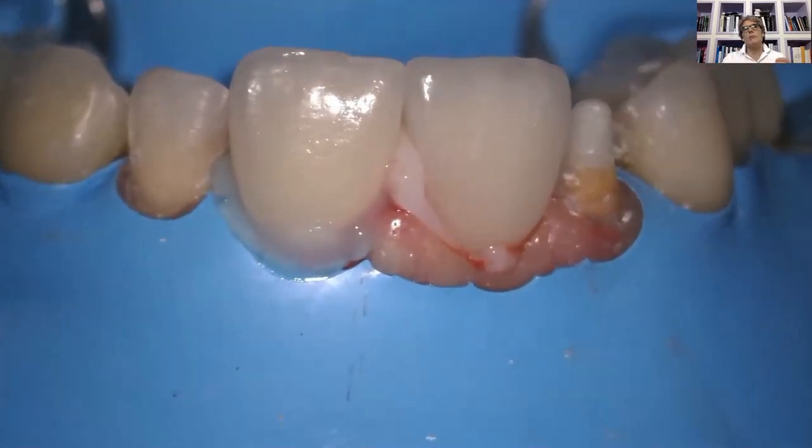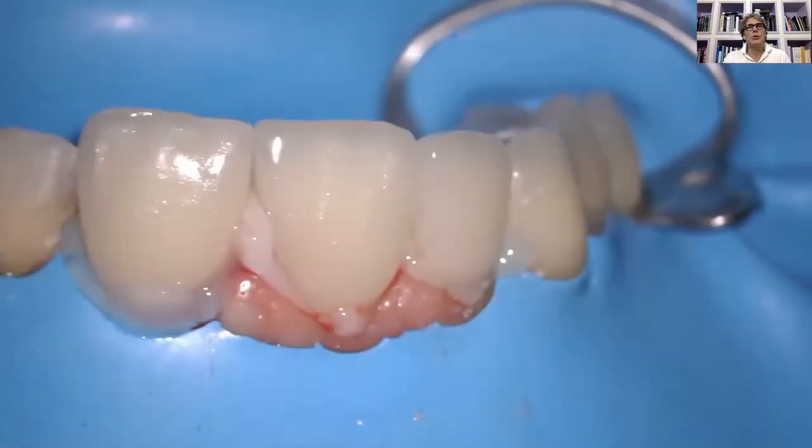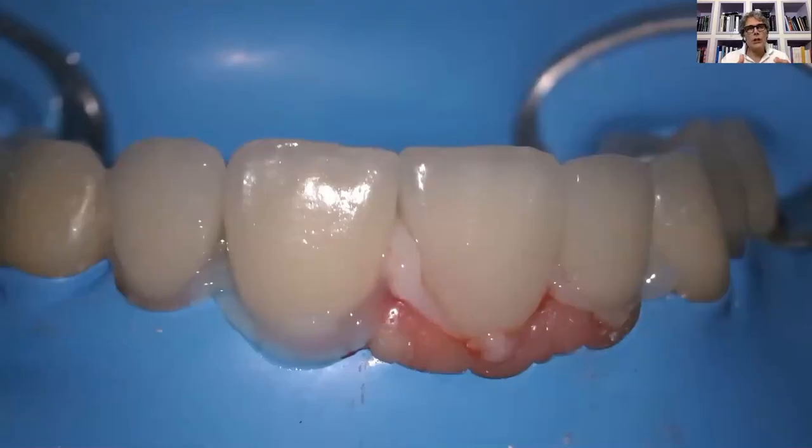In this regard, I remind you that after definitively cementing the restoration, they absorb the background color of the tooth preparation. And the restoration, if you don't try the final color with the colored glycerin, you can make a mistake, because the final color of your frontal teeth could change at the end after the cementation. As you can see from this image, on the left side I use a neutral color, and on the right side I use white colors.